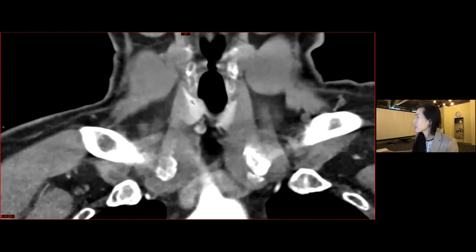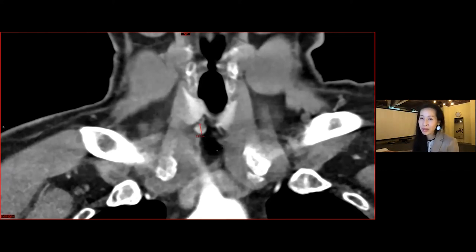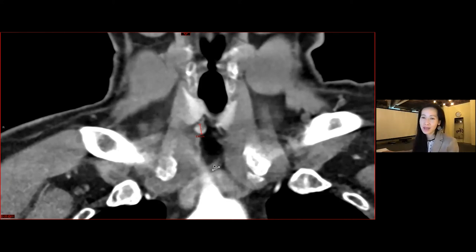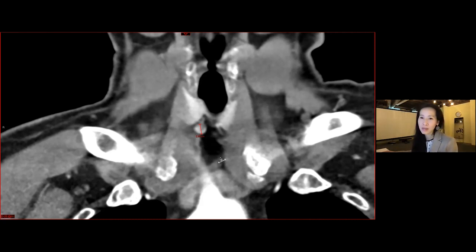So here we've got a fairly small lesion, measuring up to six or seven millimeters, but that's just one of the secondary signs. The other two are the cystic change and the polar vessel, and this one has it. So this is an inferior lesion, and we could consider this consistent with a parathyroid adenoma.